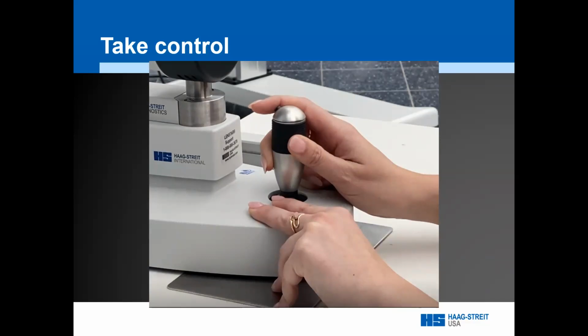Also, it's a good idea to pay attention to the typical location that the Lenstar ends up on the table when you establish the gross focus alignment. Usually this is when your thumb just barely touches the back edge of the glide plate. Once you figure out that typical gross focus positioning, the fine focus alignment will be very easy to find. Now let's practice coaching the patient.